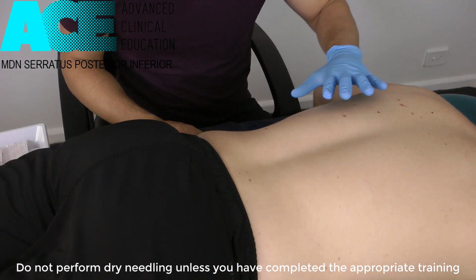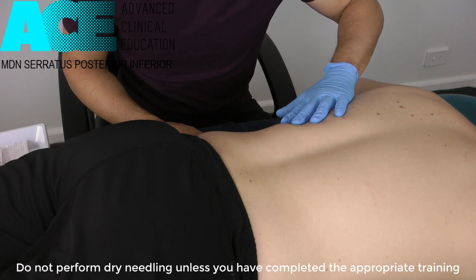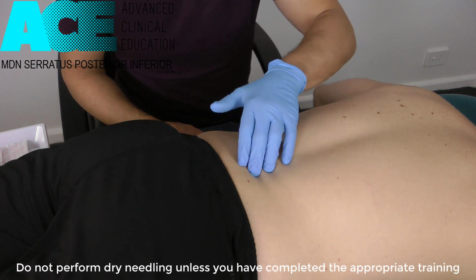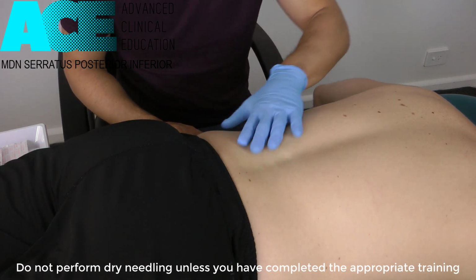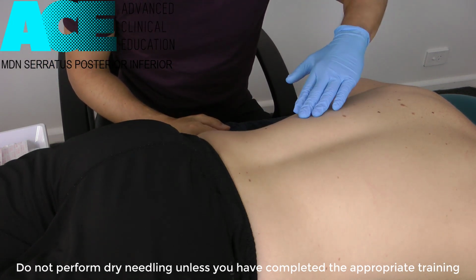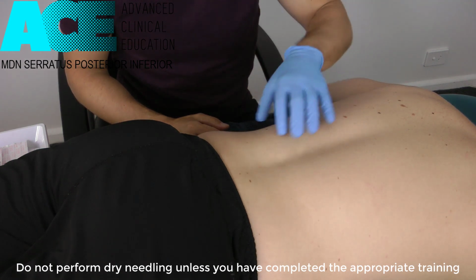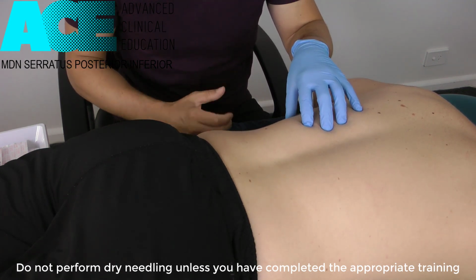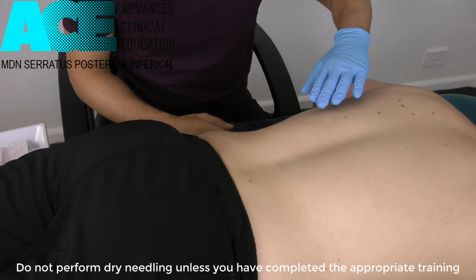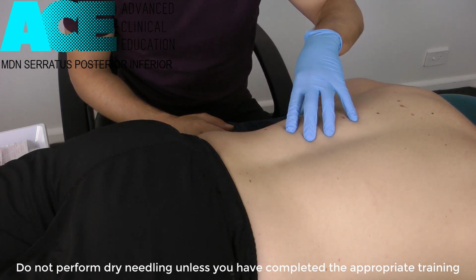Okay, so we're about to needle the Serratus Posterior Inferior. As I said before, it runs on a diagonal from these posterior ribs, angling down towards the spinous processes in the lumbar spine, like a V on each side of the lower back. We're going to angle our needle with the direction of those fibres to make sure that we're angling down away from the lungs, for obvious reasons. Pneumothorax is our biggest risk factor with dry needling, and we want to make sure that we're staying away from the lung with the direction of the needle that we're applying.